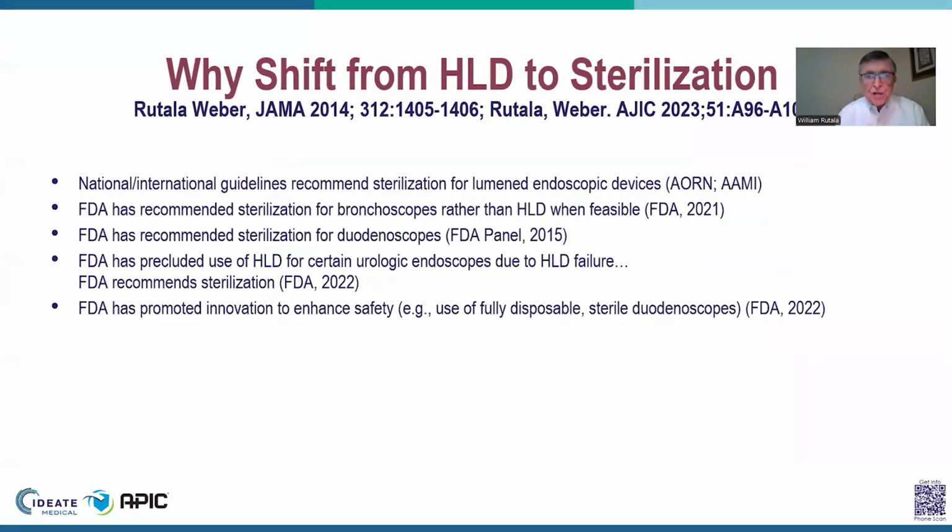recommend sterilization for lumen flexible endoscopic devices. In the next several bullets there, you'll see that the FDA has done the same thing. In an FDA safety communication in 2021, they recommended sterilization for bronchoscopes. In an FDA panel conclusion in May of 2015, they recommended sterilization for duodenoscopes.